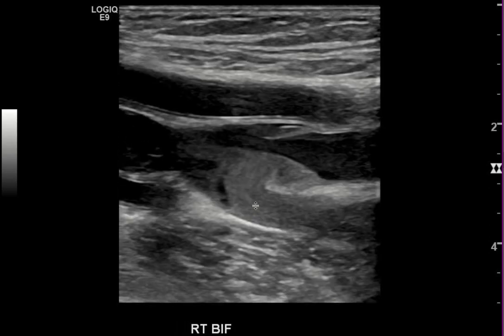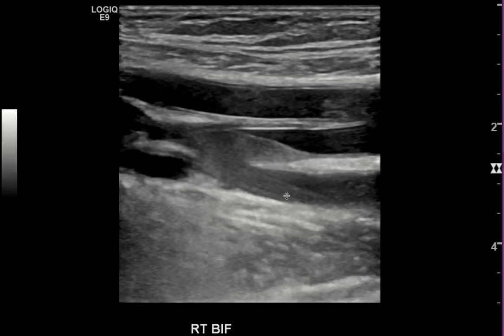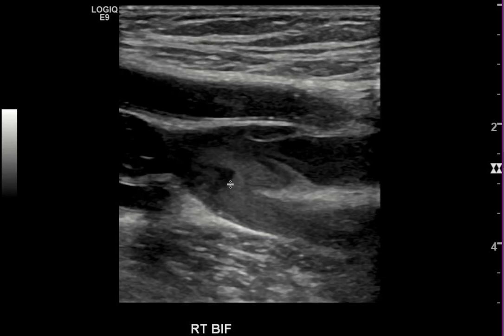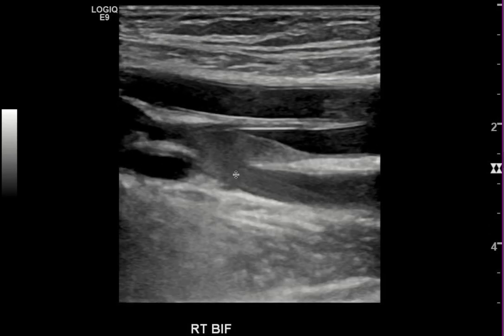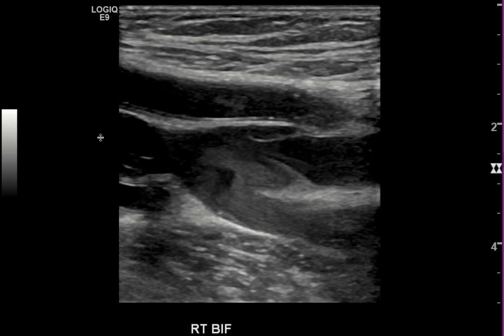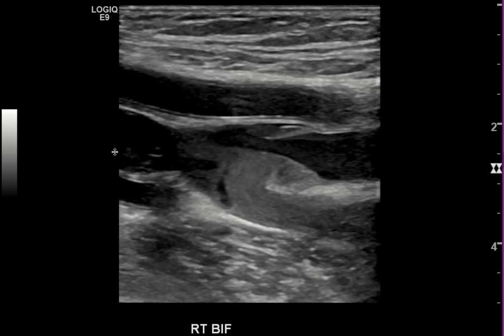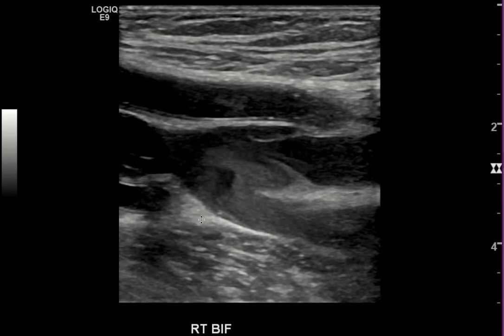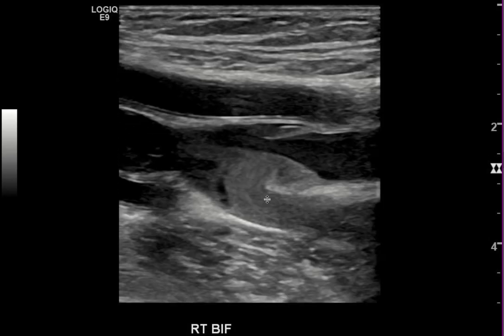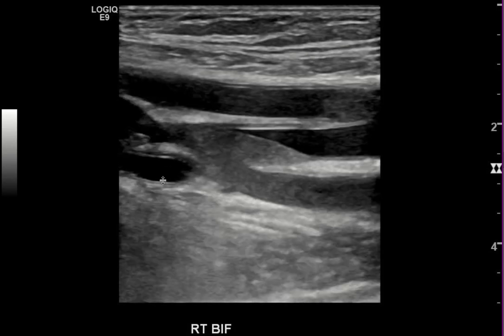The clinical significance of this is sometimes questionable. The slow flow could predispose one to develop deep venous thrombosis, since slow vascular flow can lead to that, so that's something to look out for. You can also see this if the blood is having a hard time getting more proximal in the body, so looking closely to see if there's a more proximal reason for venous occlusion is important when you see this. But I think the key importance is to not mistake this for a deep venous thrombosis.